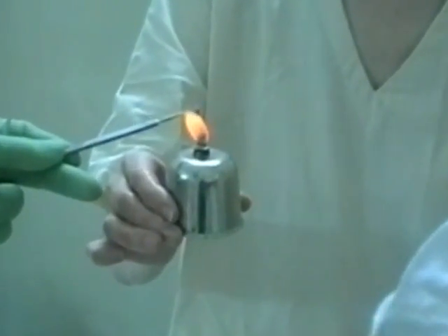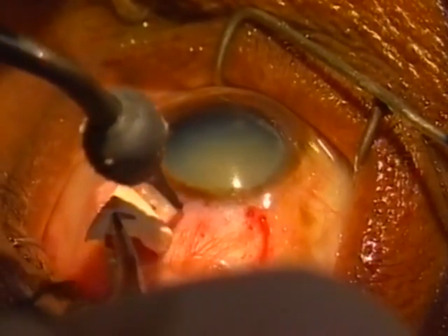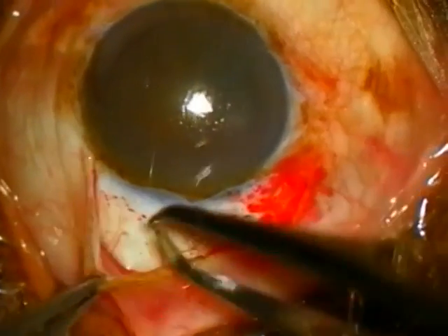Following this, the sclera is very gently cauterised by using a hot metal rod or cautery forceps as shown here.